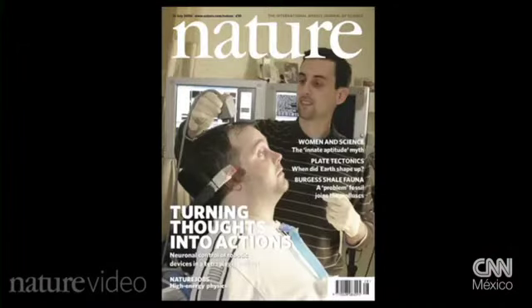So our idea is to bypass that damaged nervous system and go directly from the brain to the outside world, so the brain signals can not control muscles but control machines or devices like a computer or a robotic limb. The trial is called BrainGate. The team announced their first success in 2006.